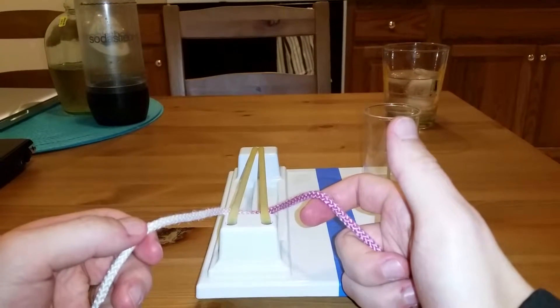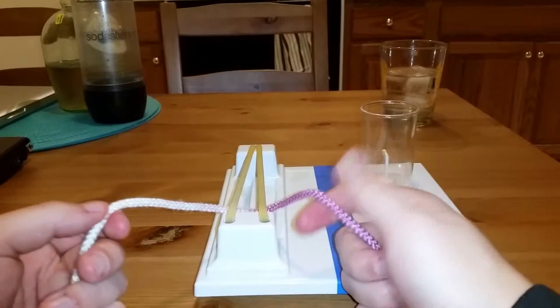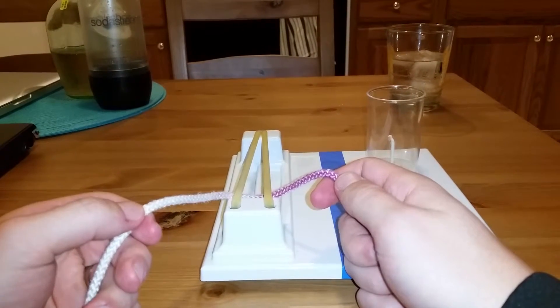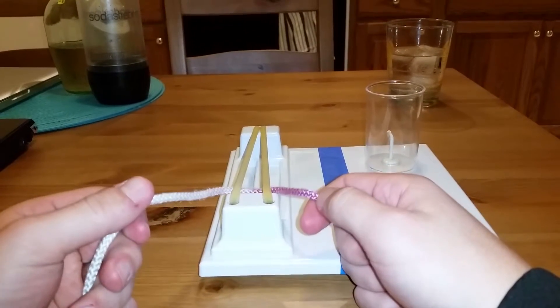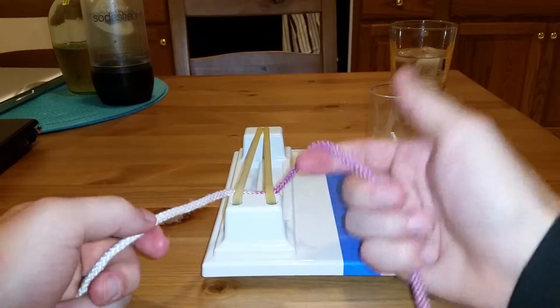Hey guys, this is going to be a practice video for right-handed two-handed surgeon's knots, also known as square knots. If this is confusing for you, go back to our instructional video. This is just so that people that have learned from the instructional video can see these knots in quick succession so they can get the flow.